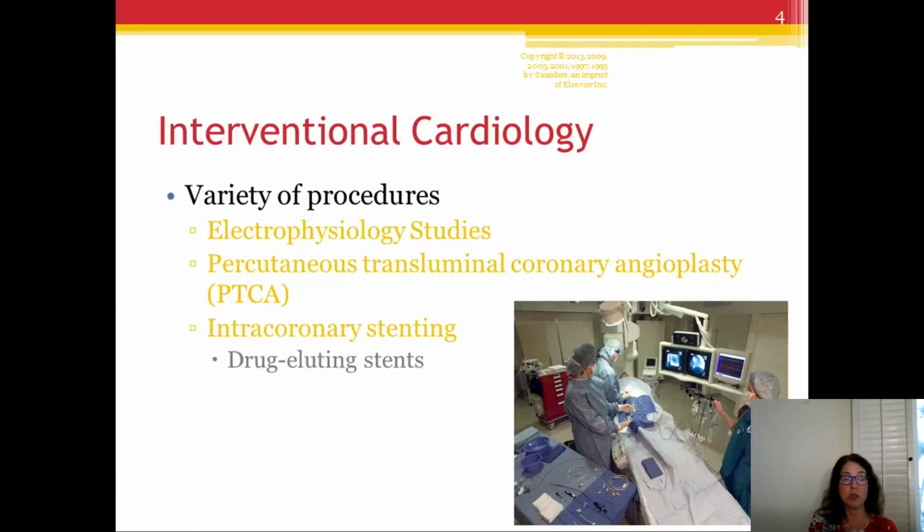Very common for supraventricular tachycardia patients. It's very disruptive, it's dangerous. If you can find the place, usually it's near the node, where it's the driving force, they actually ablate that little area, kill it off, and then people potentially can be relieved of the problem altogether. So it'd be electrophysiology studies.